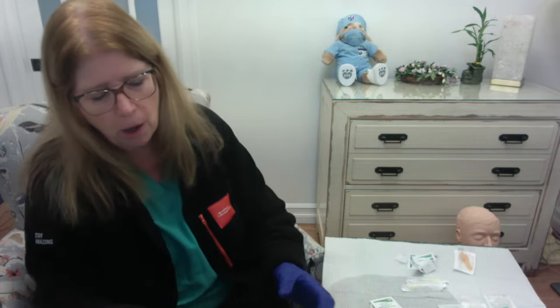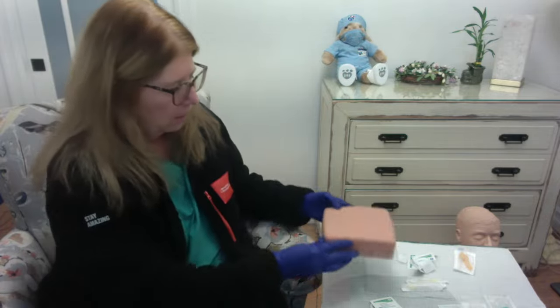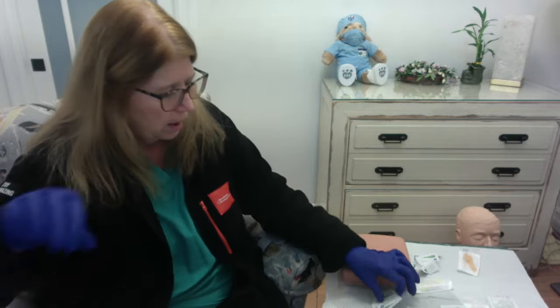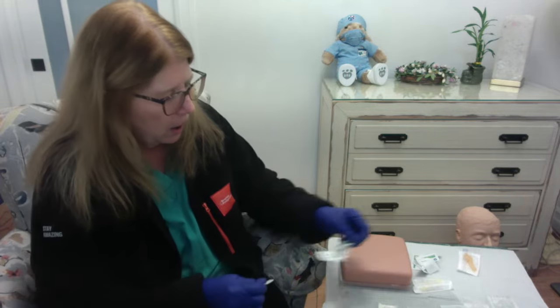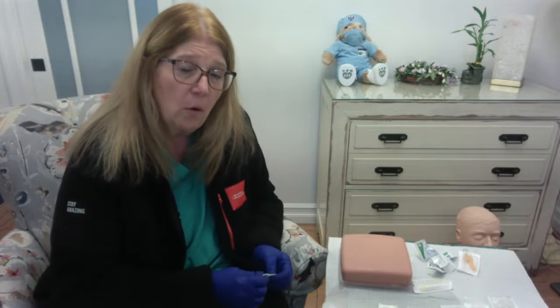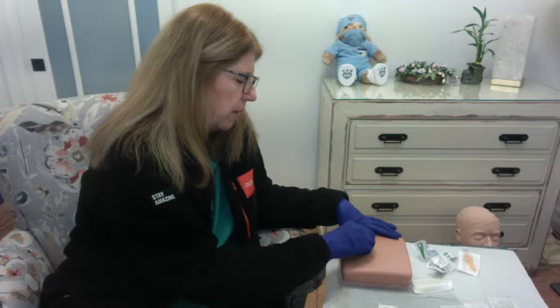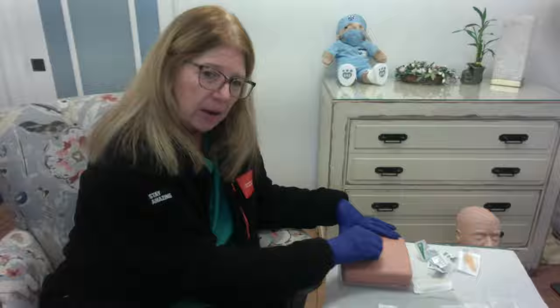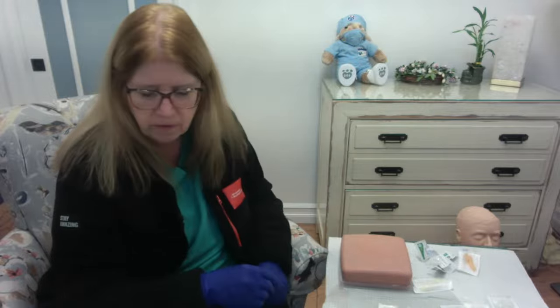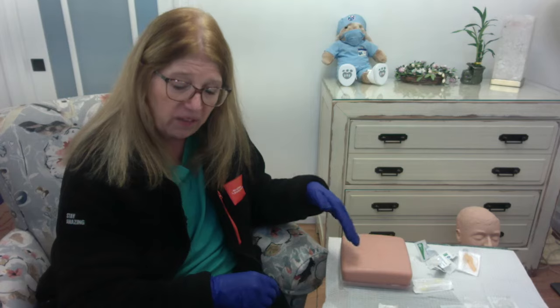Okay, so intradermal. So I have this little arm here. I'm going to put it here on the corner so that you can see a little bit better. Have an alcohol swab. Now, some references say that you do not even need to use alcohol for an intradermal, but we're going to use some alcohol. I'm going to clean this area starting in the middle, making some concentric circles around. I'm going to make sure that this alcohol dries completely. I'm not going to blow on it. I'm not going to fan it.